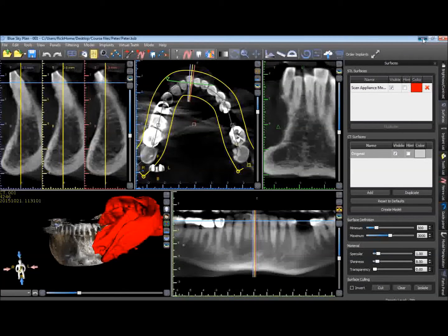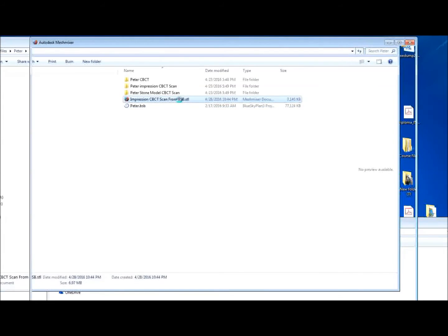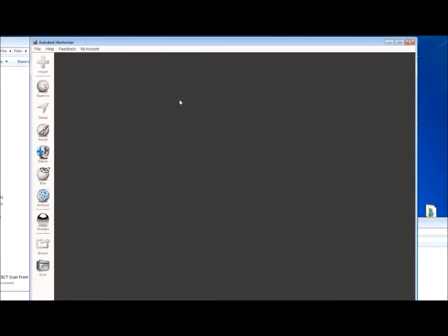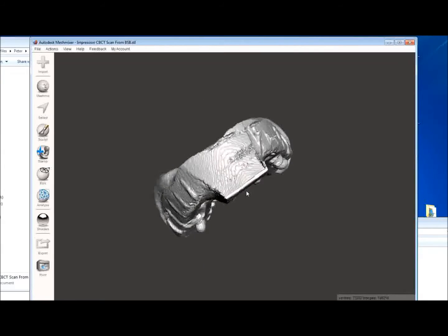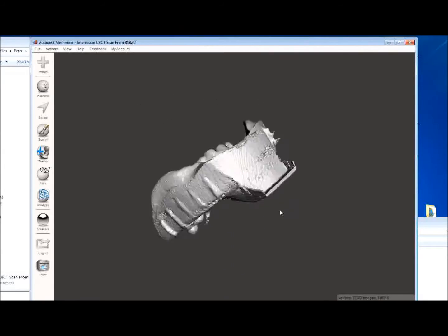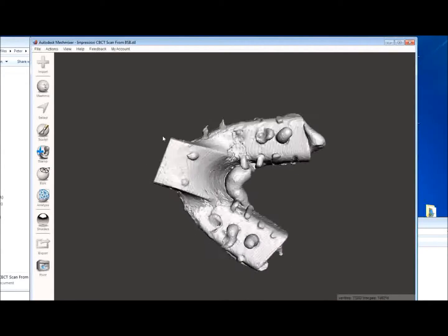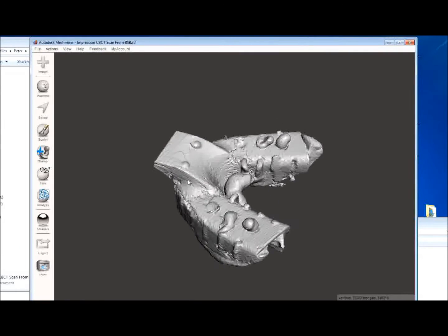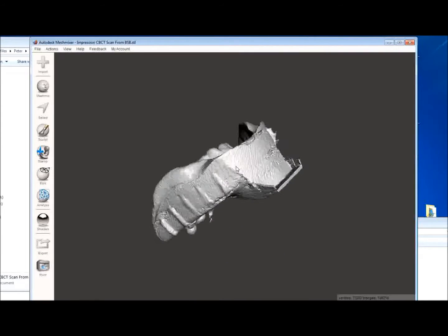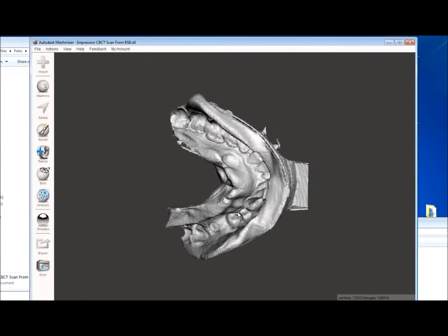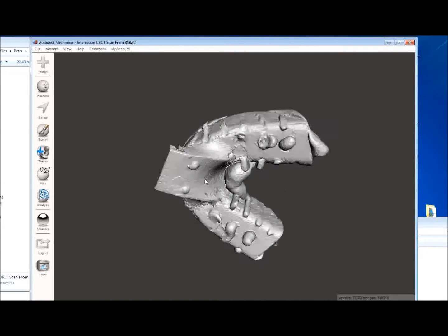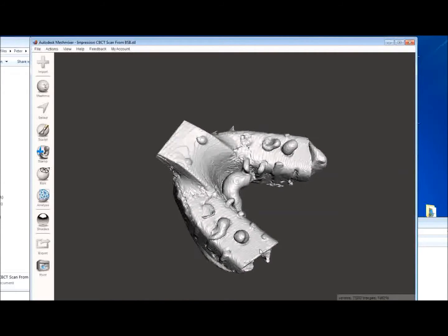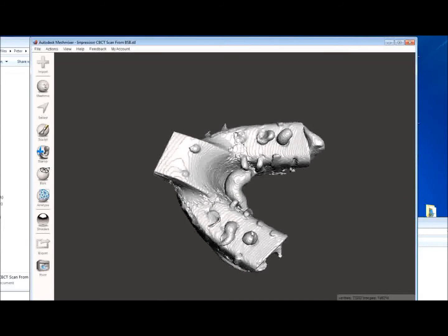Once that's done, we can now open this STL file in Mesh Mixer, and we're now going to demonstrate how to reverse this image. As you can see, what you have here is the entire impression. What we want to do is invert it so that this negative area becomes a positive. And we do that by understanding that this is a shell file. It's empty inside.